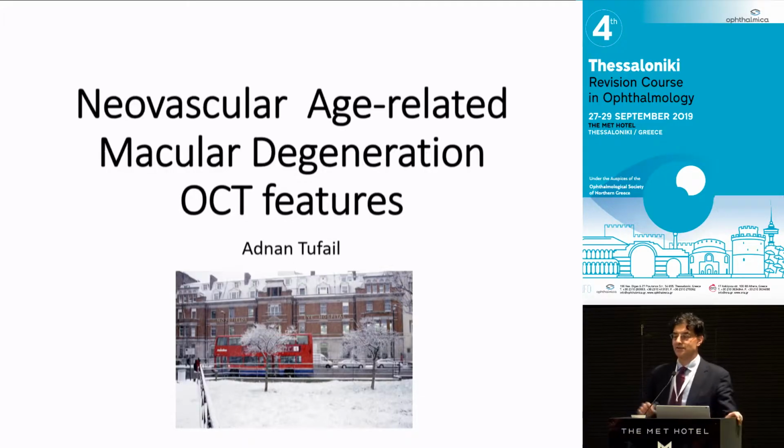So what works best is just pure pictures. So the first talk is just pictures. And the pictures are just very simple. It's those, how do we diagnose the different types of choroidal neovascularization that we see in our clinics?